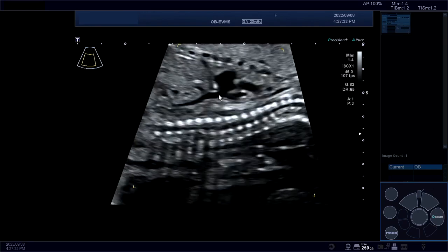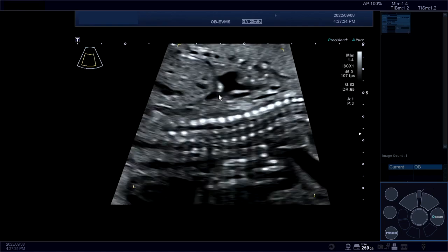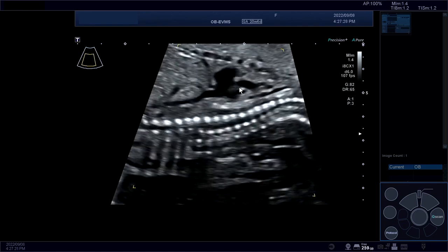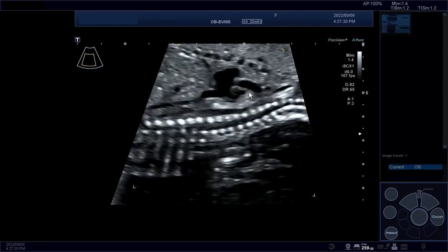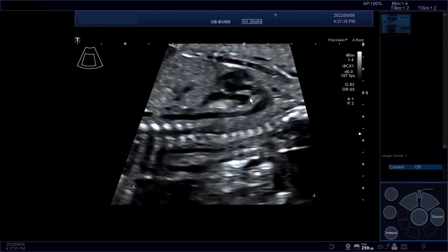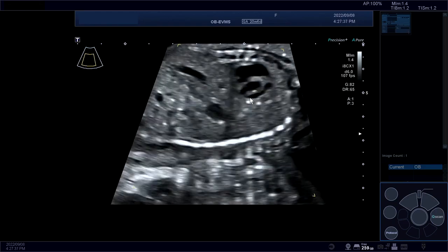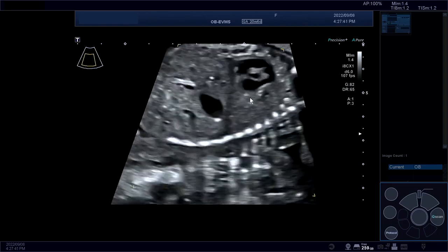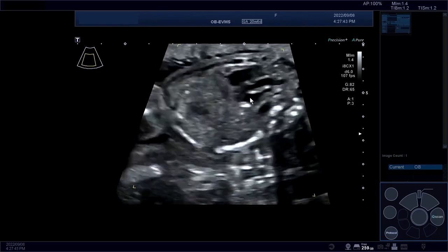So I am right parasagittal here. And here's the branch pulmonary artery under. I'm right parasagittal here. Then I go a little bit more sagittal, I get the aortic arch because I'm angling from right to left, and then if I go more towards the right side, then I get the pulmonary artery coming out. Important planes to look into.